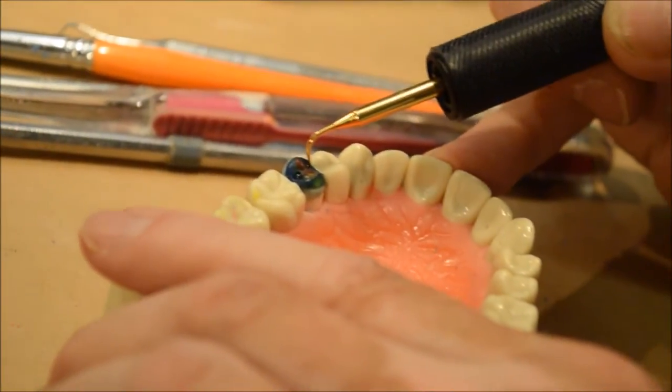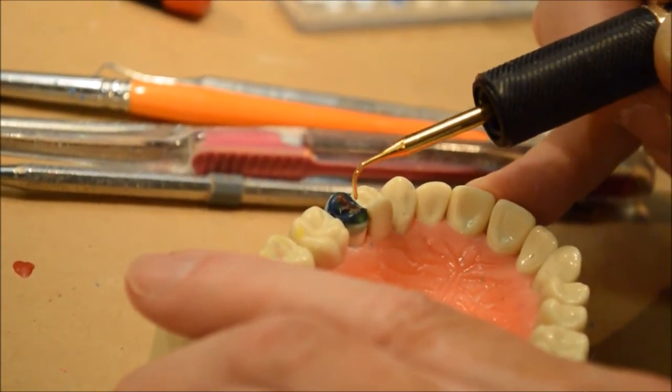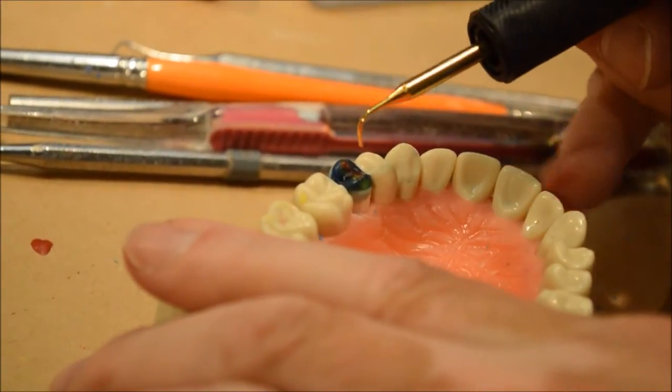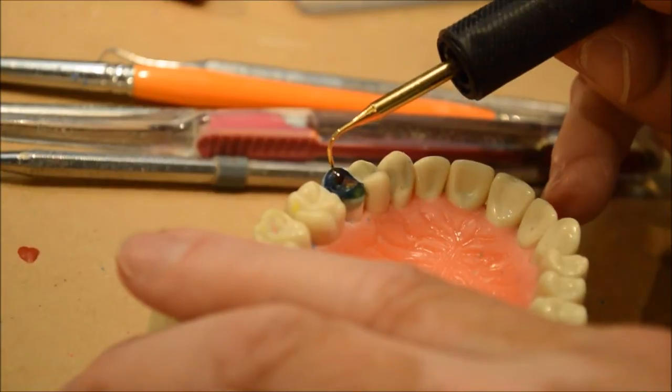I'm putting that in there to make it smooth and take away the real sharpness. It cleans up the wax by doing that.